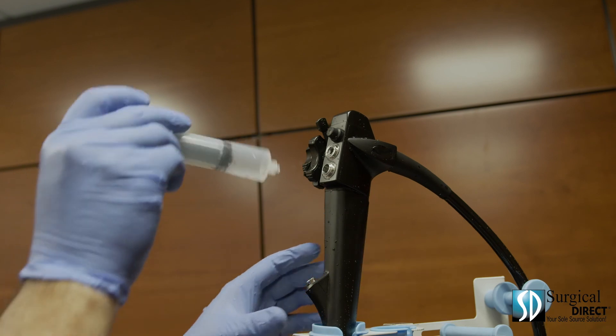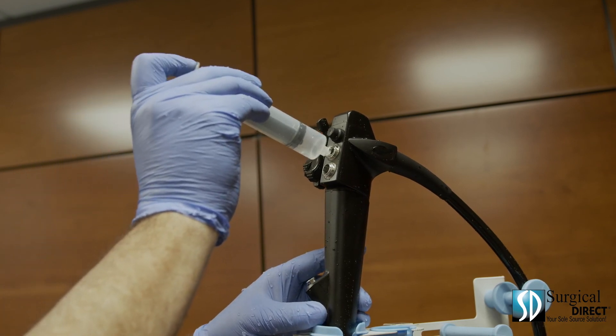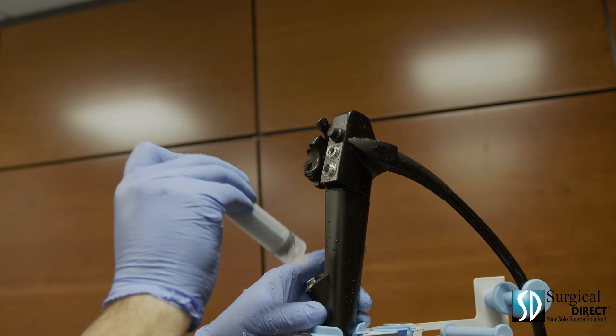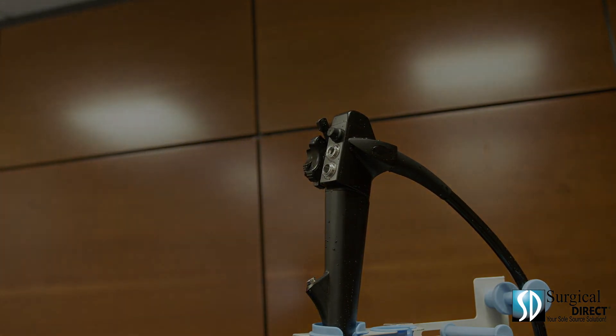When hanging the scope, use a syringe with 15cc of alcohol. Quickly push 5cc of alcohol through each channel. Allow the scope to dry overnight.